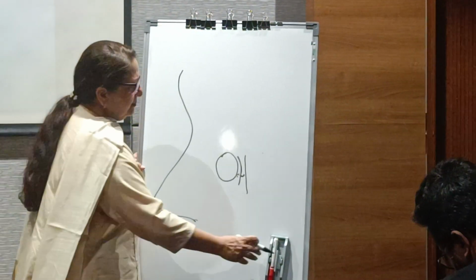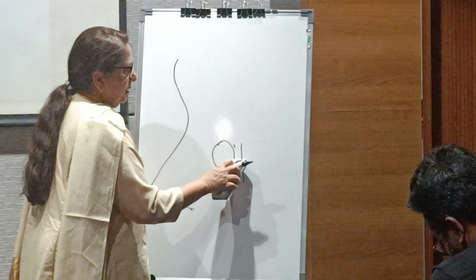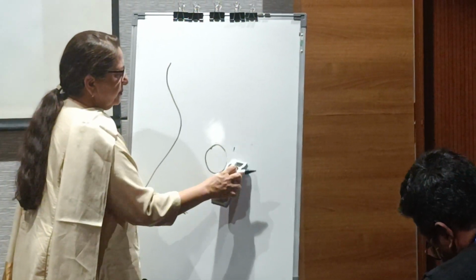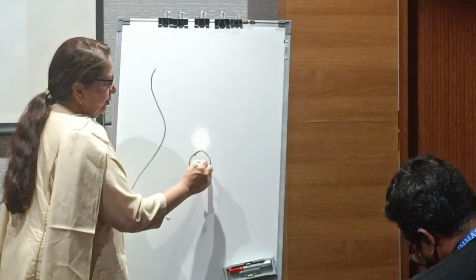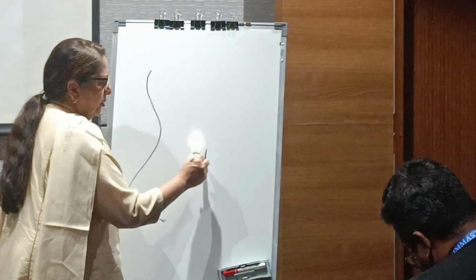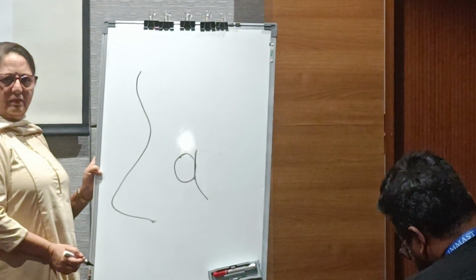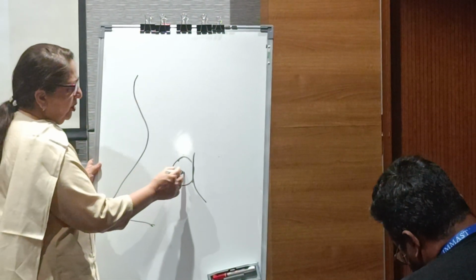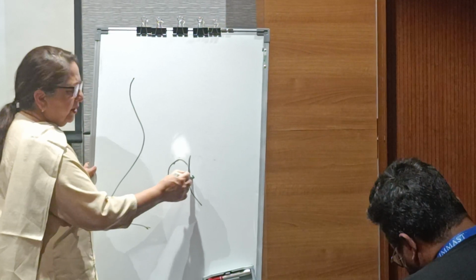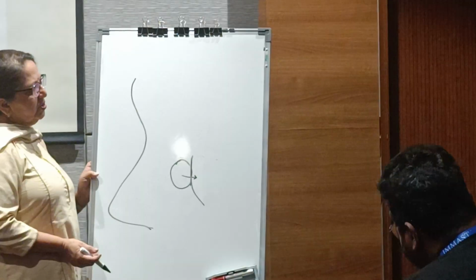But sometimes there is no retrobullar recess, and the posterior wall of the bulla is the same or is fused to the ground lamella. Can you understand that? So when you go through the posterior wall of the bulla, you are already gone beyond the ground lamella. This happens quite often, right? So this is what we do.